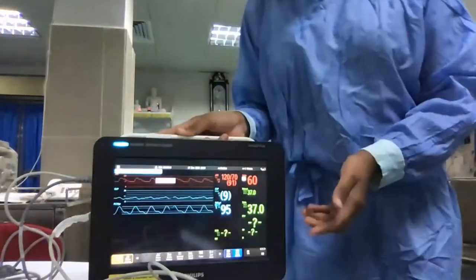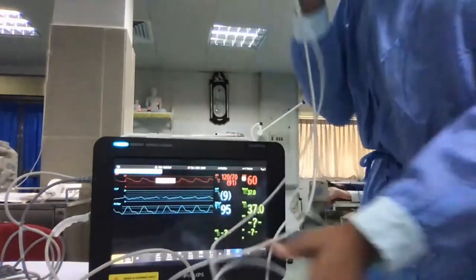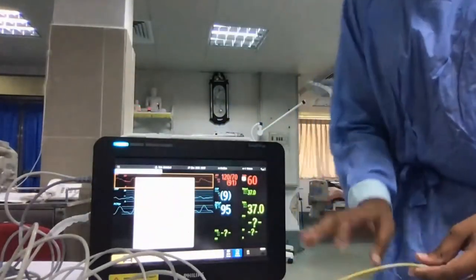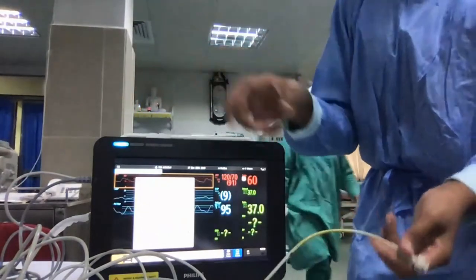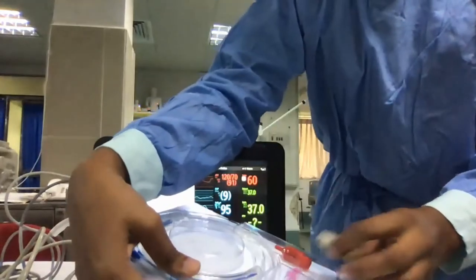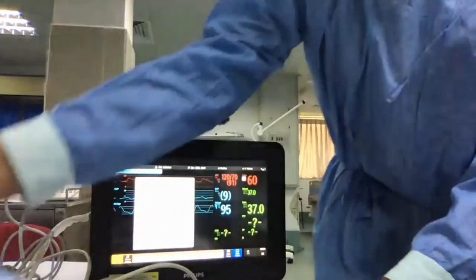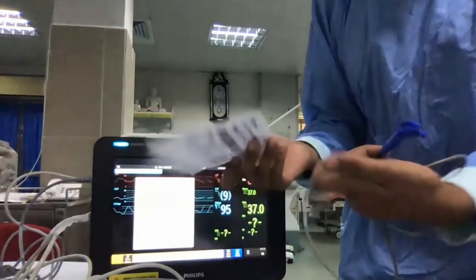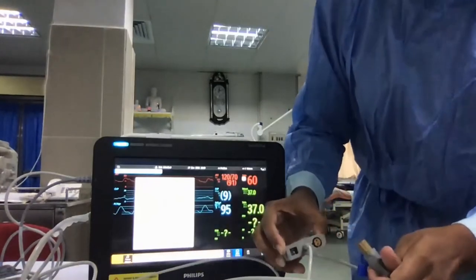So, shall I come? Okay, so this is the cardiac output cable. Like we saw in the video, the procedure, you need to set up the CVP line and the arterial line, and that arterial line has to be a femoral line. Then this red port should be connected here, and the other one should go into your arterial transducer kit. And through the distal most lumen of your CVP line, you need to connect the temperature port. The temperature probe is connected to the brown color port over here.